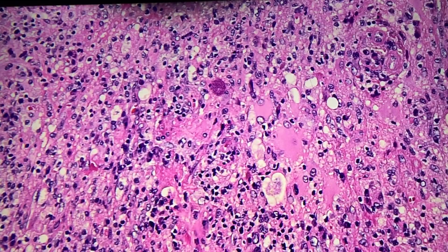Josephine, how are we doing for time? 5 minutes. Okay, you want to give them a take-home message for this case? Take-home message, if you see a lot of lymphocytes and histiocytes, back off of thinking neoplasm, even if you see necrosis. Yes. Okay, great.